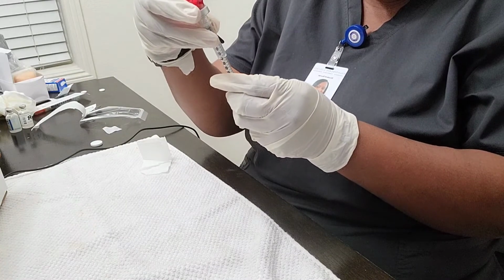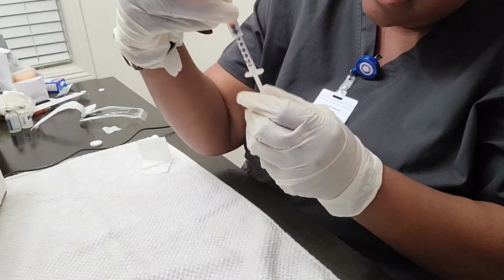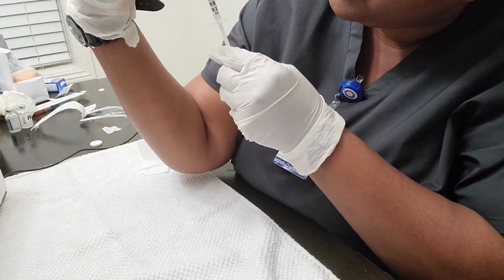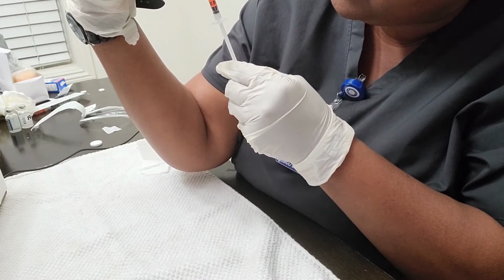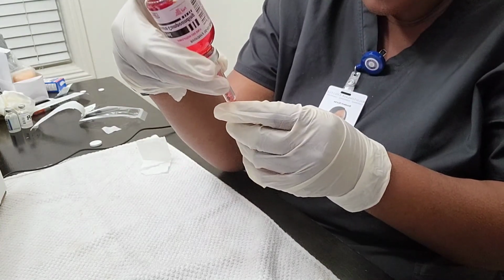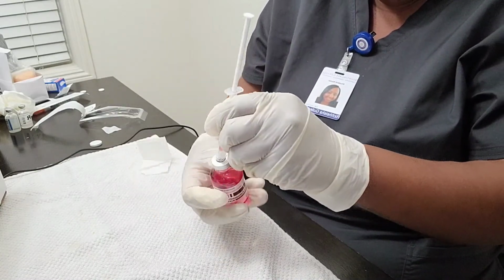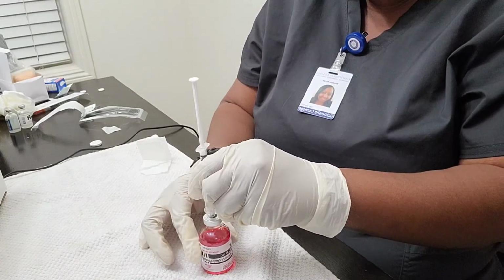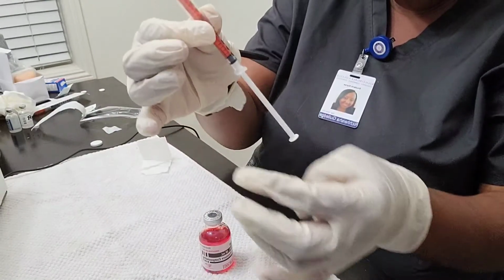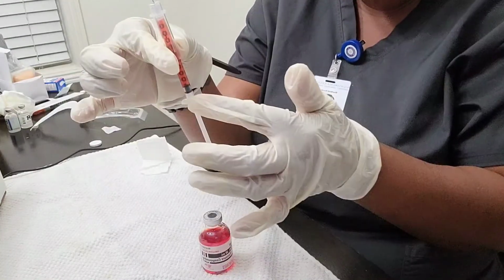and then I will pull back until one milliliter. Okay, and then I will remove it. All right, the medication of heparin, 1 milliliter.